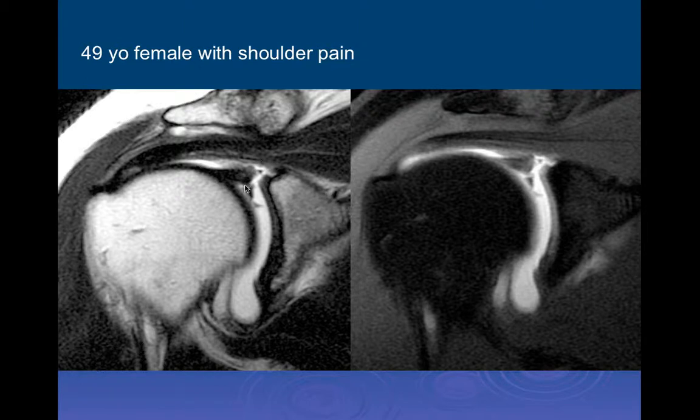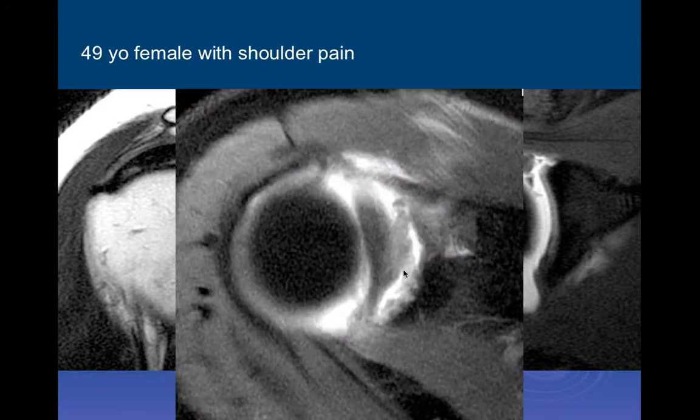Okay. And again, this is probably the labrum, which is torn and displaced. I would describe that in your report. This is the biceps anchor, which we can see is clearly separated from its attachment to the superior glenoid. So we're dealing with a tear and displacement of both of those entities. Here's really where the tear is going along, with the biceps anchor being ripped off and the superior labrum. So I would just describe it so the referring physician knows that's what's occurring here, and he could then say, oh, this must be a type 2C because you've described it that way. But the main thing is that both are torn and displaced.